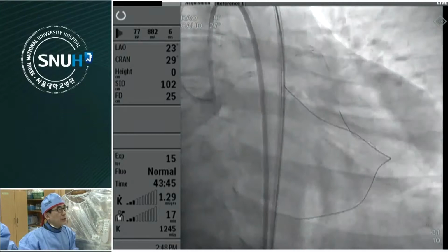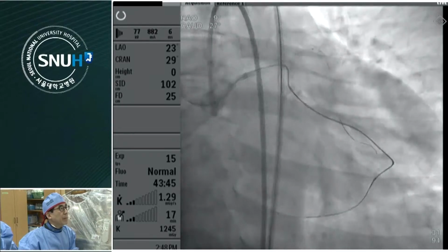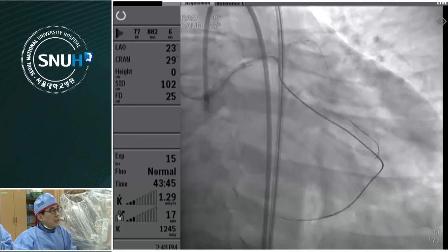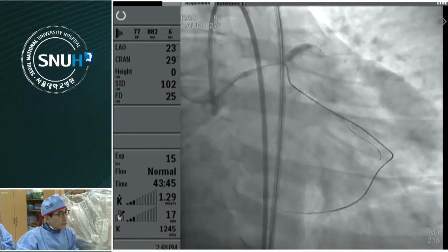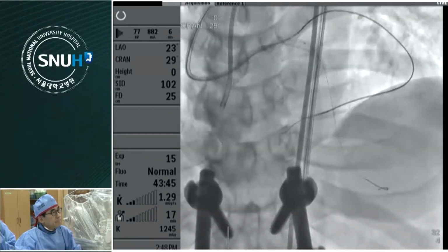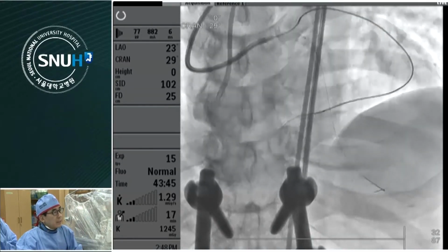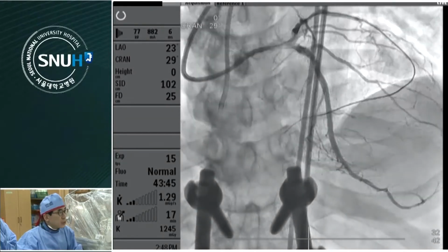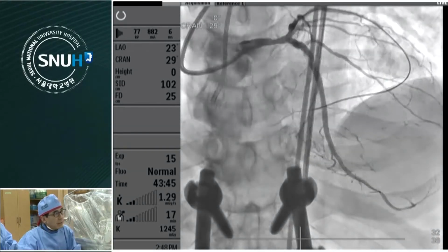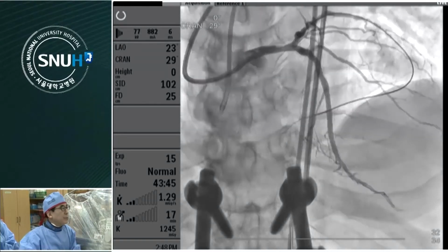In other words, we used the anchor balloon technique at the proximal LAD, stented segment, with a 3.5 balloon, and then changed the Corsair with a newer one. Then we were able to pass the Corsair into the draining PL branch. This is an angiogram to confirm the Corsair is in the PL branch, and I switched to the stiff wire at this point to puncture the distal stump, with Gaia first, second, and Conquest Pro.